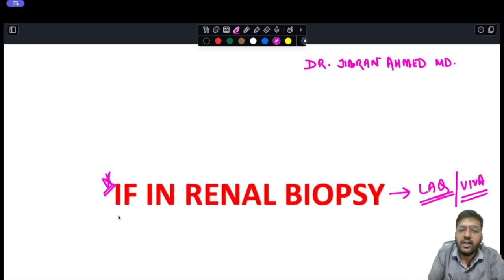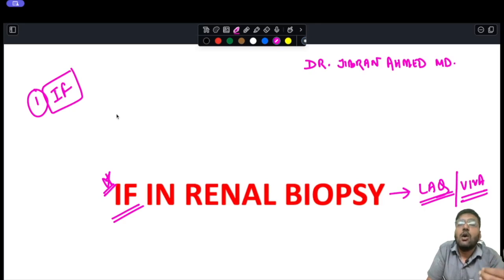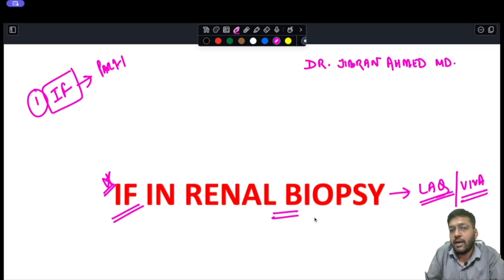So we are going to start off with the role of immunofluorescence in renal biopsy. Now, before we proceed forward, I would just like you to first go through certain lectures before you try to watch this particular series. So this is basically a continuation of the series. We have already read in detail about immunofluorescence. Okay, so what is immunofluorescence? What are the principles of immunofluorescence? What are the types of immunofluorescence? Okay, what is the working of the immunofluorescent microscope, and what are the applications? Okay, we have read in detail about them in the chapter of immunofluorescence, that is the part 1 lecture. Okay, and today we are going to see in detail the applications of immunofluorescence in the interpretation of renal biopsies. Okay, so this is the part 2. This is the part 2 of this particular series.